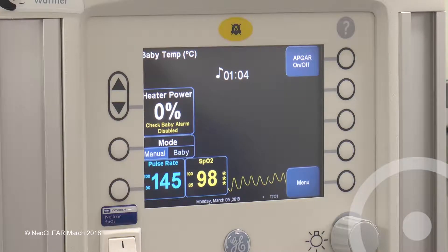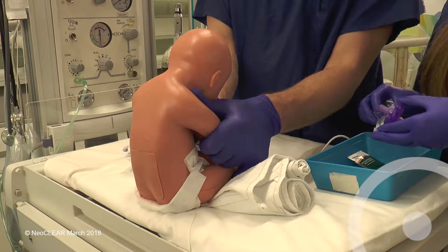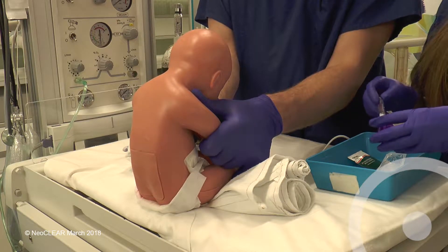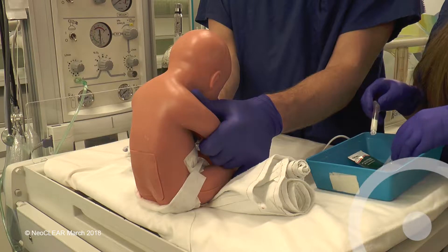The second assistant should be checking the monitor throughout for the lowest and highest heart rate and for the lowest SATS with a reliable trace. The procedure can be stopped or paused if the baby is felt to be compromised. The first assistant can relax their hold while the operator re-washes their hands and puts on the gown and sterile gloves.